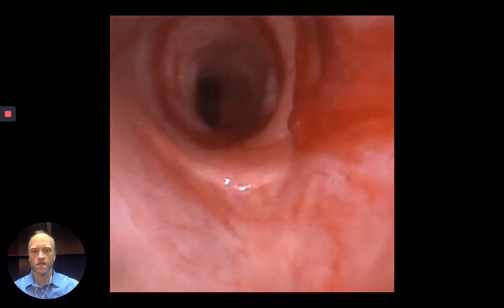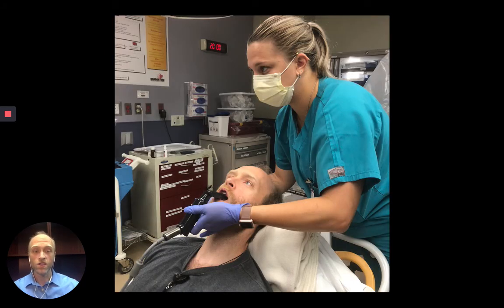And another successful intubation. As I mentioned, you can also use a video scope. When using a video scope, it is vital that you obtain a dense block to the posterior tongue and epiglottis, as those are going to receive pressure.